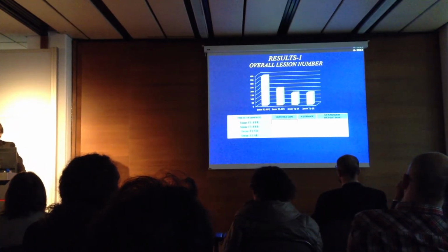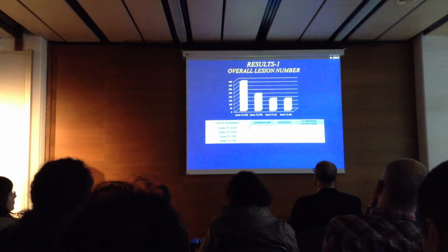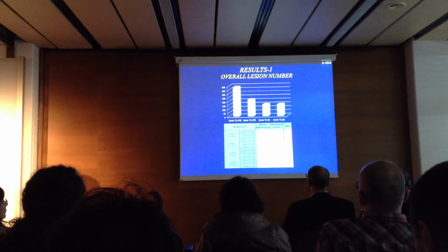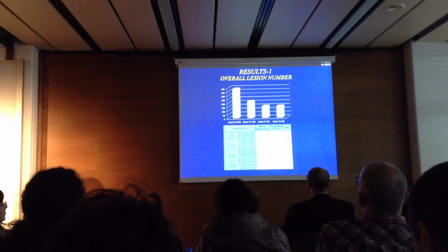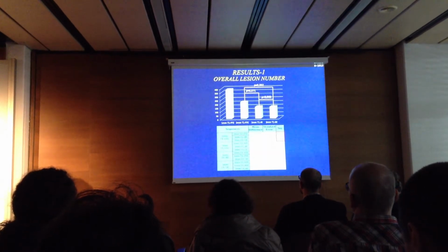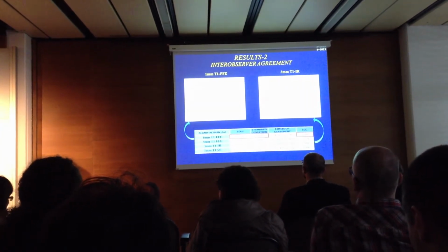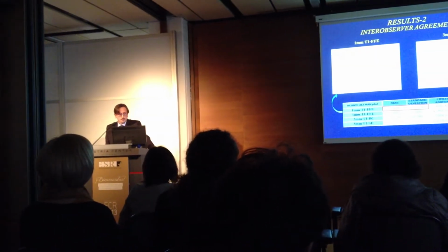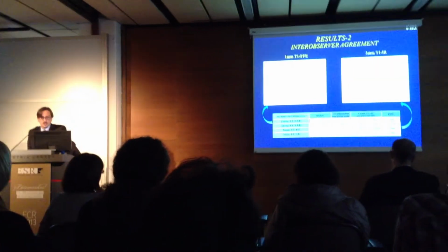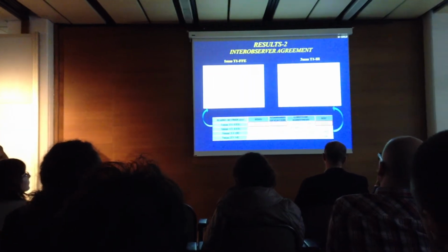The highest number of T1 hyperintense punctate lesions was observed in the 1 mm reformatted 3D fast field echo sequence. The ANOVA test demonstrated there was a statistical difference between the 4 T1 weighted sequences, but only the 1 mm fast field echo sequence resisted the post-hoc analysis. In fact, there was no statistical difference between the 3 mm T1 weighted sequences. Regarding the results of inter-observer agreement analysis, there was a moderate to excellent agreement for all T1 weighted sequences, except for the inversion recovery, which showed the lowest interclass correlation coefficient and the highest standard deviation in the Bland-Altman plot. The highest agreement was observed again for the 1 mm fast field echo sequence.